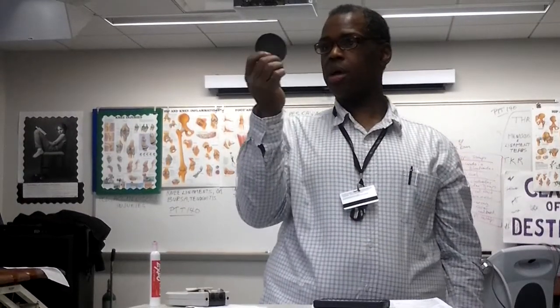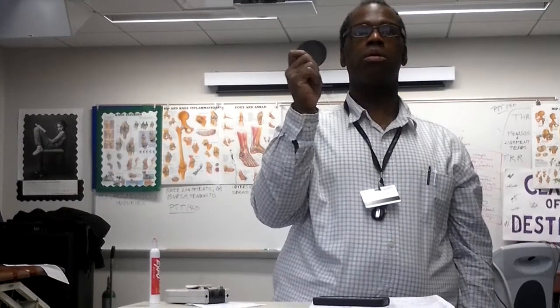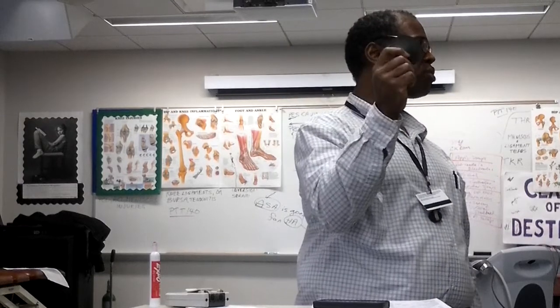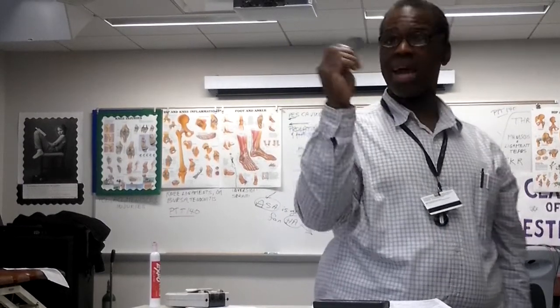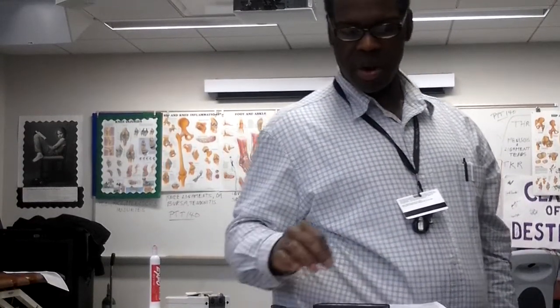Gel. Water. What's the problem with water? It evaporates, so I don't want to use it for motor, but I can use it for sensory. Good. Okay.